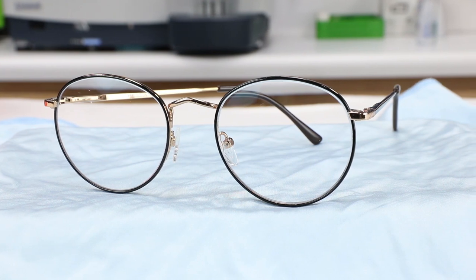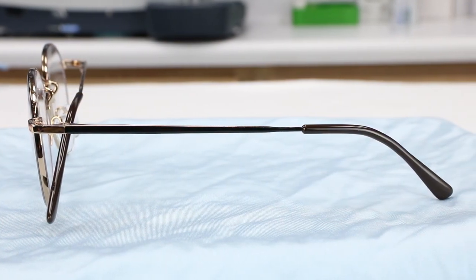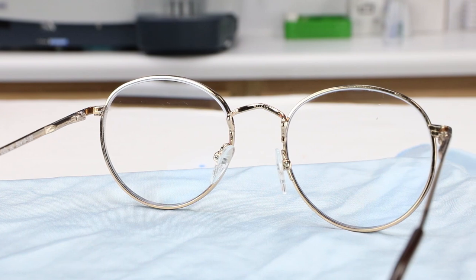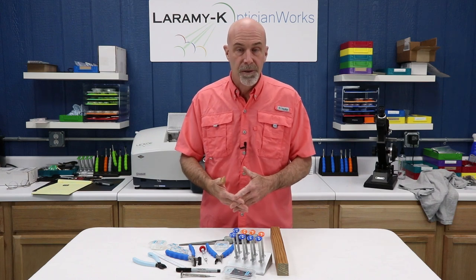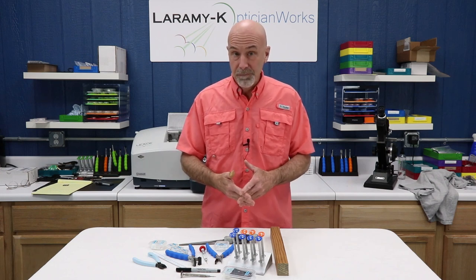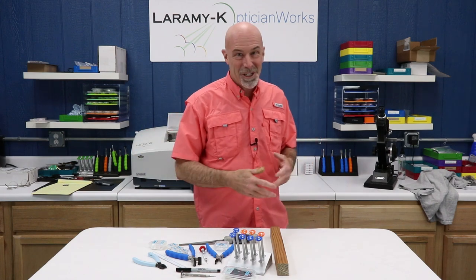This pair of glasses came to me with temples that were too short for the wearer, loose eye wire screws, loose temple screws, poor alignment, and with one nose pad glued on and both of them quite yellowed. And about half an hour later, look at them now. Every pair of glasses that you get your hands on should be an opportunity for you to shine. For you newbies, it's also an excellent opportunity for you to practice and build your skill set. It is stuff like what we just did that sets you apart from others. It's also something that no online retailer can possibly offer. Show people that you are different — that you are a Laramy-K Optician Works optician.